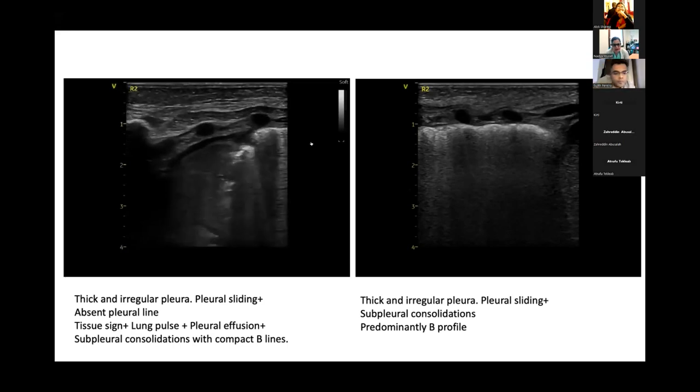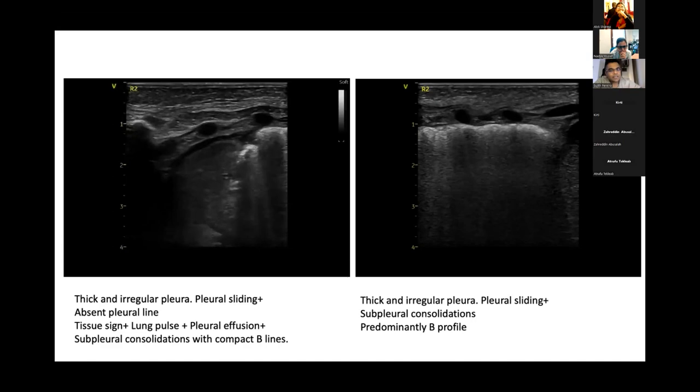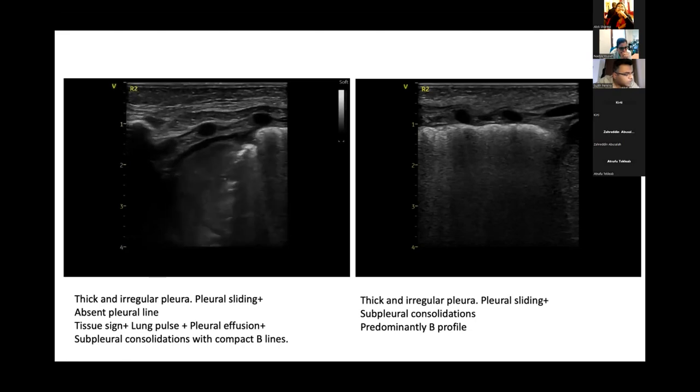Well, going back to your scans, I think I have a little bit of a problem. They're a bit dark on my screen, so maybe they might not be the same with yours. But it's an interesting image. Is this something that later resolved, the one that you said was R1, but you've labeled R2? Sorry, this is mislabeled. So it is actually R1. Please go ahead. R1, there has always been a right upper lobe dense collapse that this baby's had, at least on the x-rays that you're seeing. There's always this persistent collapse on the right upper zone.